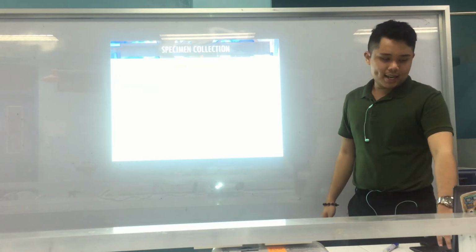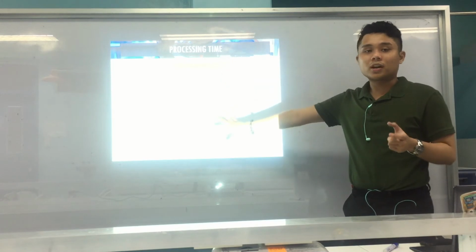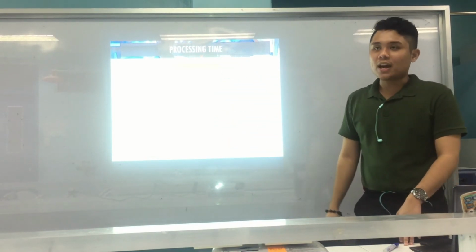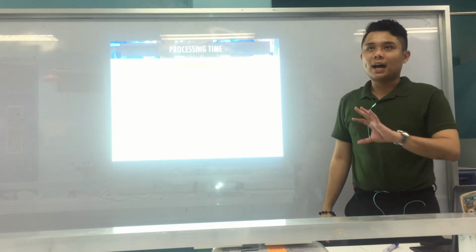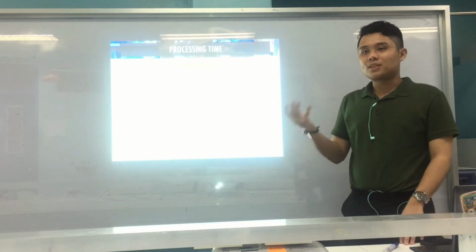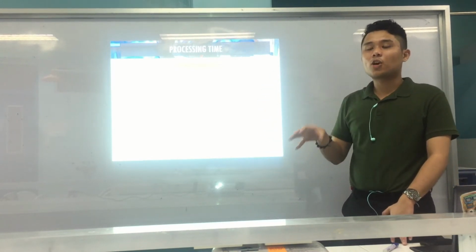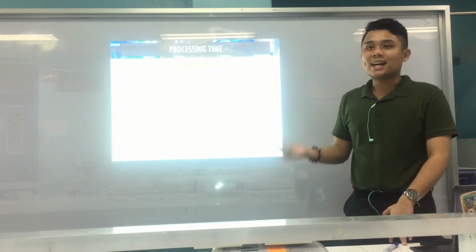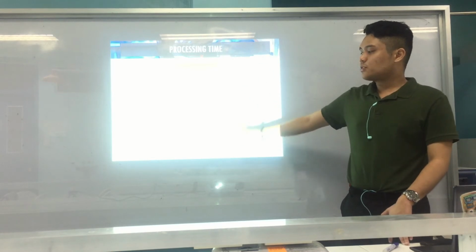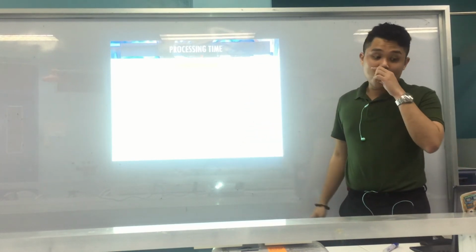Okay? All right. So, again, there are two types of stool specimens: unpreserved or preserved. If unpreserved, like fresh, it should be processed within 1 hour. Okay? Within 1 hour. So it should be delivered to the lab and processed by the medtech within 1 hour. And if preserved, for example from a swab, or if a preservative was added, though for bacteria or culture we don't add liquid preservative like formalin. So, if preserved, it's viable within 24 to 48 hours at room temperature in holding media.